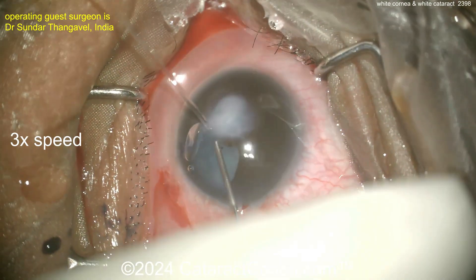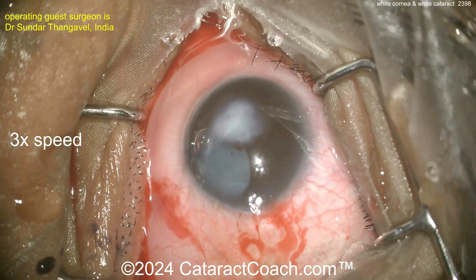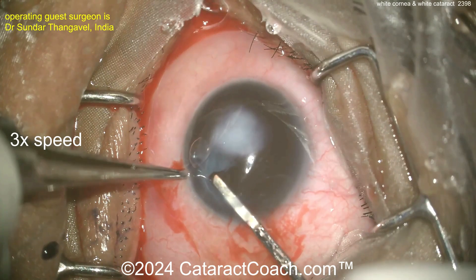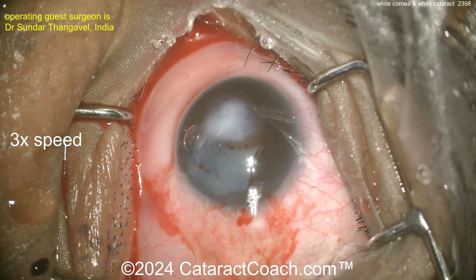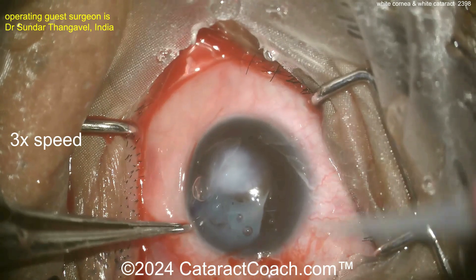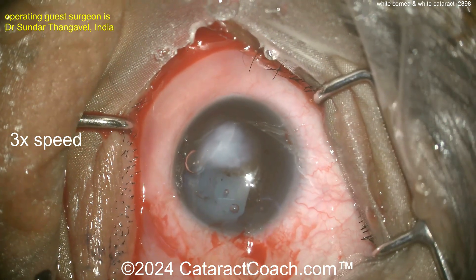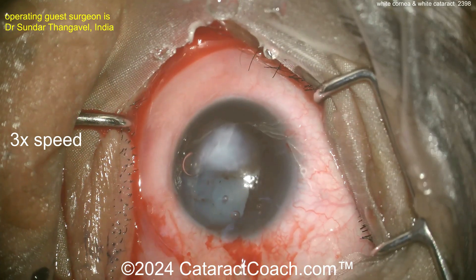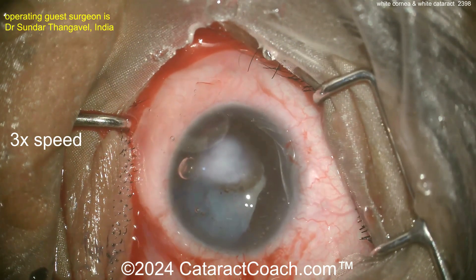Putting a little bit of blue dye in, here's the viscoelastic going inside the eye. You may have to break off any of those adhesions. There's the spatula — go careful there. A blunt dissection is probably a better option in this case. More viscoelastic going in. You may need to put some iris hooks in to expand that pupil for a better view. Here's another paracentesis, and a good sweep with the cyclodialysis spatula to ensure you've broken off those adhesions.